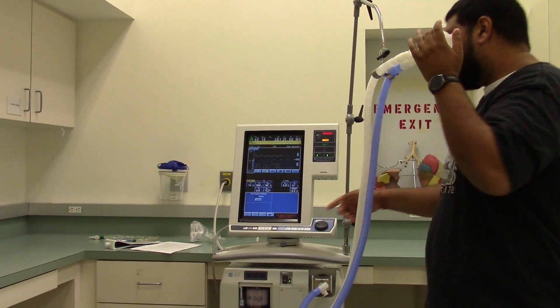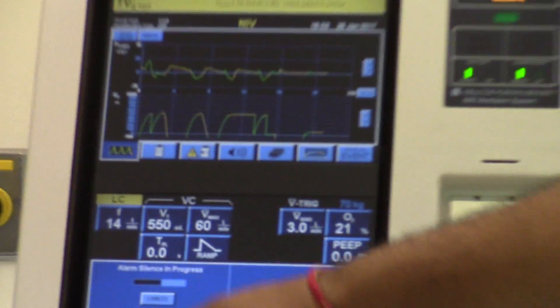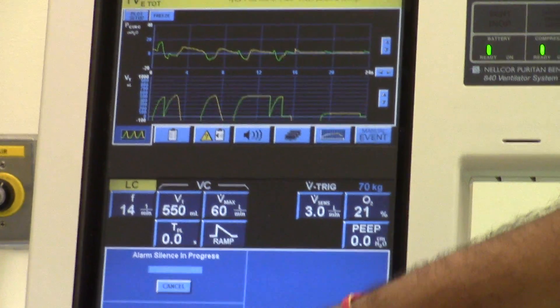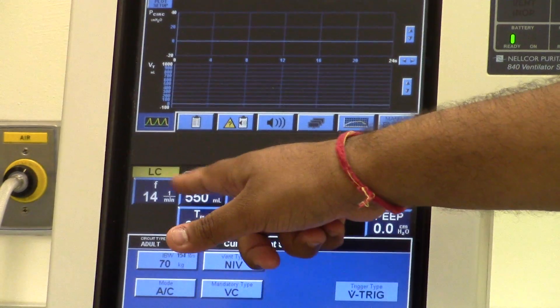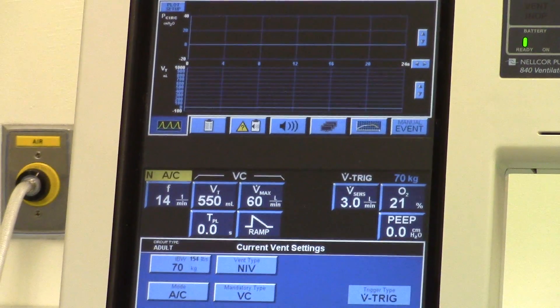We're actually going to have to change the settings here, to match the patient's breathing so that we don't get continuous alarms. But if you look at the graph, it's delivering multiple breaths because it detects small pressure changes.